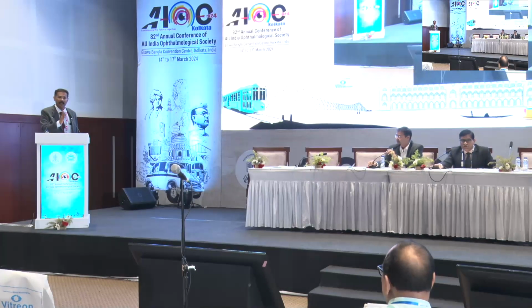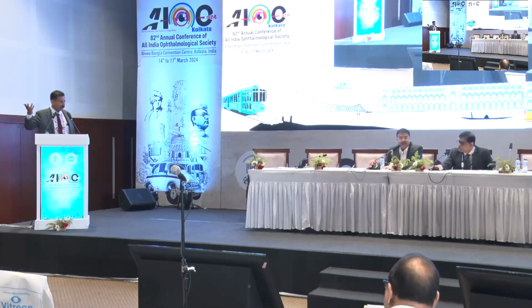We don't have any financial interest in that. Epsilon makes very good ones. Indo-German makes very good ones. These are the two which I know. Bangalore Cardiocare. I used Epsilon, it is very expensive, but expensive is one side, and cheaper ones which break off easily are on the other side. This lasts longer. If you buy for 5,000, it will break off in 3 months. If you buy for 15,000, it will last longer. So Cardiocare, they have a very good material.